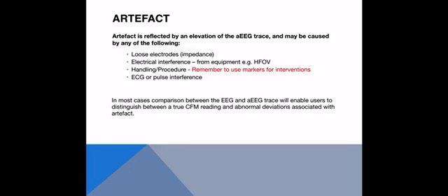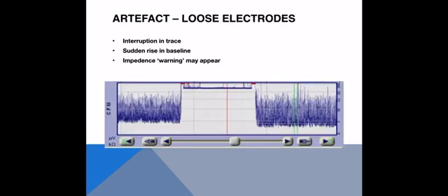This trace shows high impedance: the trace is interrupted and the baseline has risen up. In this case we need to review our electrodes and possibly reposition, re-secure, or replace them.